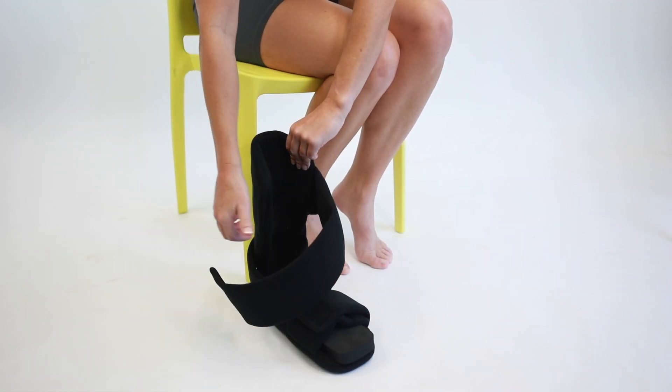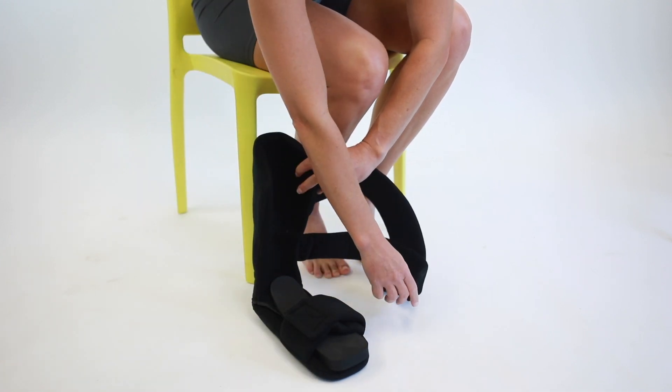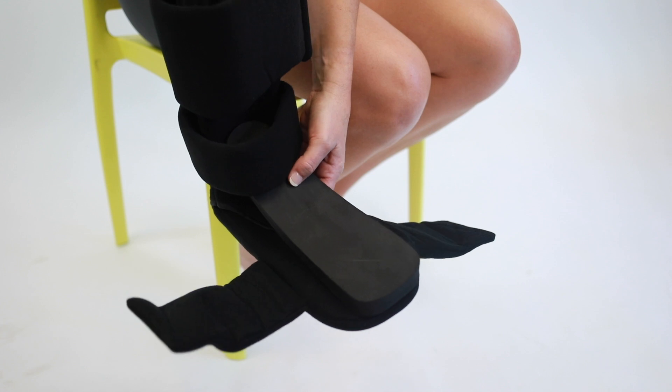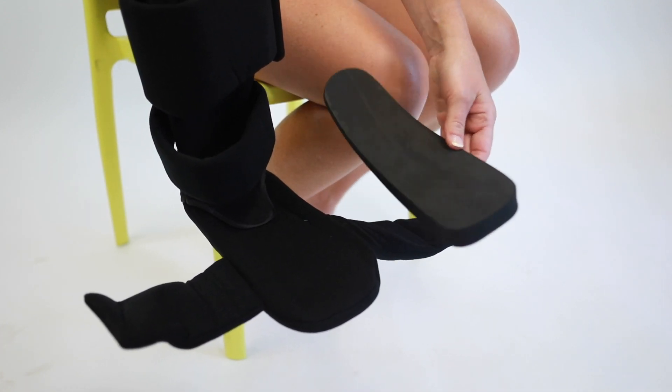Unfasten all the Velcro straps. Remove the dorsiflexion wedge if desired. For additional stretch, place it into the splint.